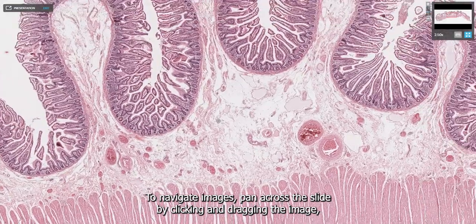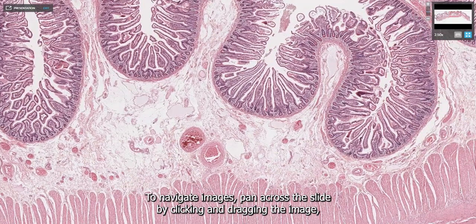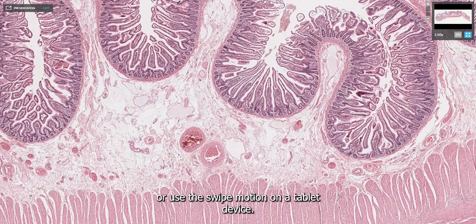To navigate images, pan across the slide by clicking and dragging the image, or use the swipe motion on a tablet device.